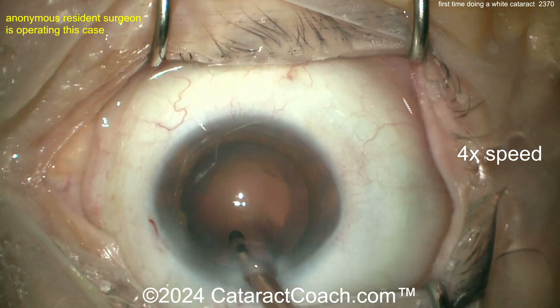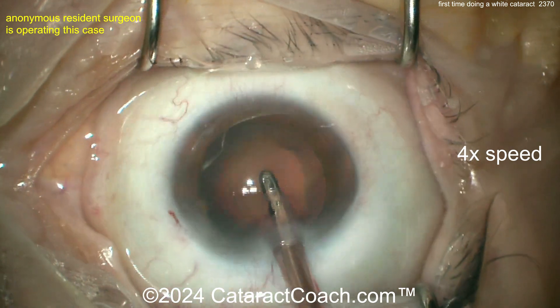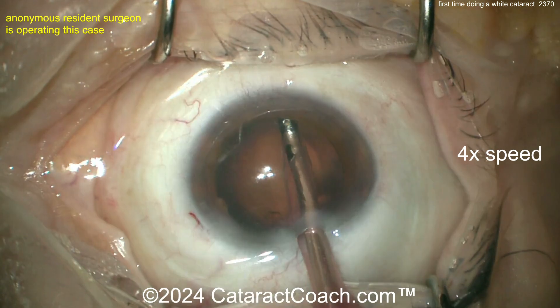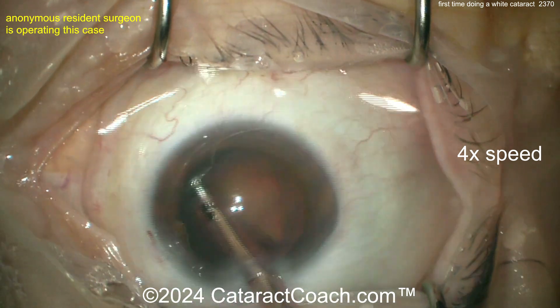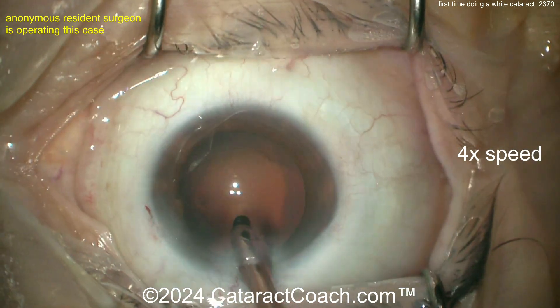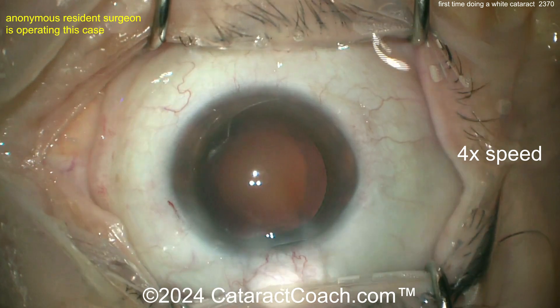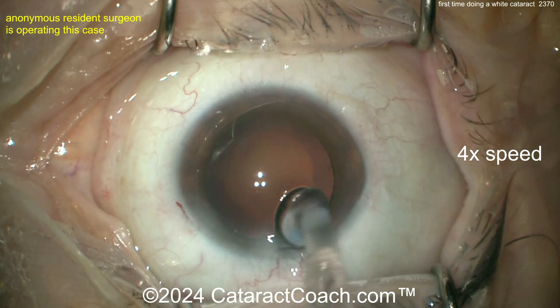Cleaning up the cortex — this resident has done a great job. How many surgeries do you think this resident has done? I'd say at least 200. Some things that gave it away: going in and out of the incision many times, and the number of grabs during capsulorhexis creation. But the things I did like: the way the nucleus was rotated, the grooves were made, the nuclear pieces were separated and brought up — the phaco technique was actually quite good.